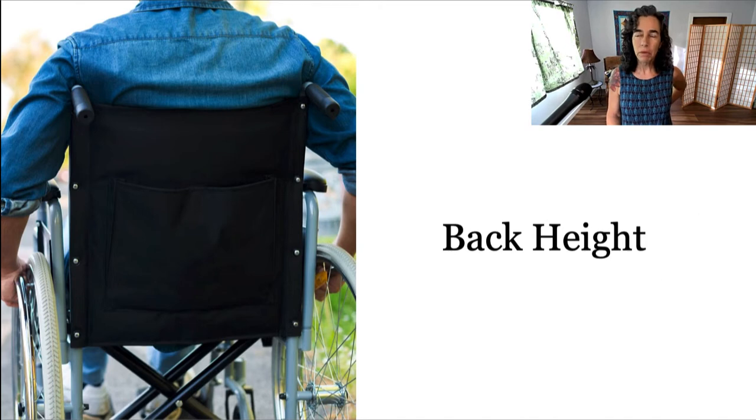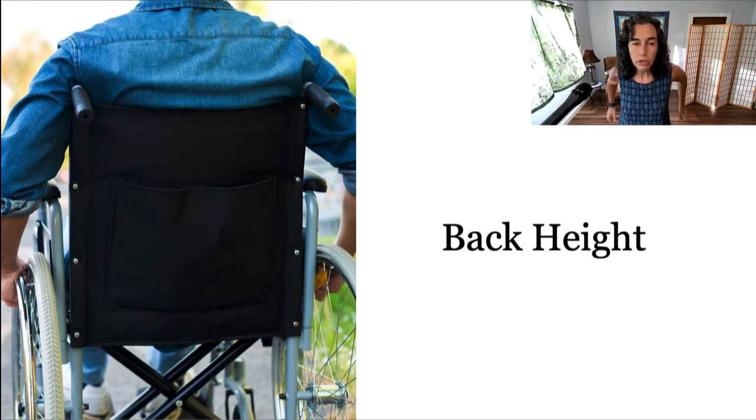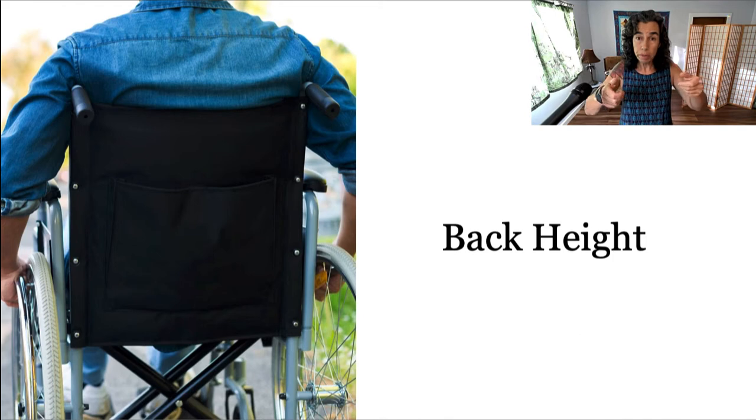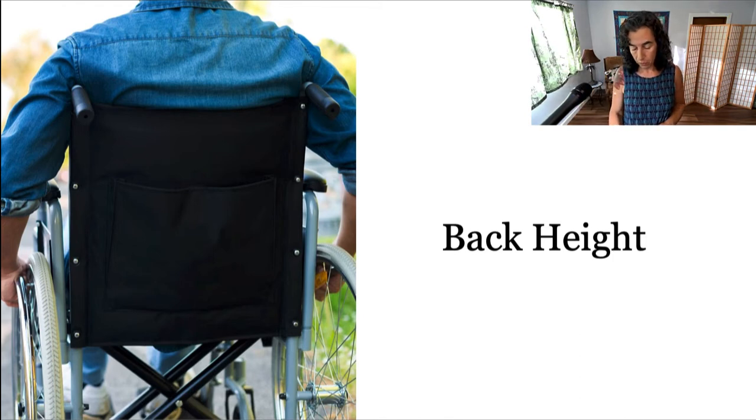So we're going to get rid of it both for weight considerations and also so that you don't have that back interfering with your push. And we can customize the back height of a wheelchair. And notice on this chair, there are push bars for a caregiver to push the wheelchair.